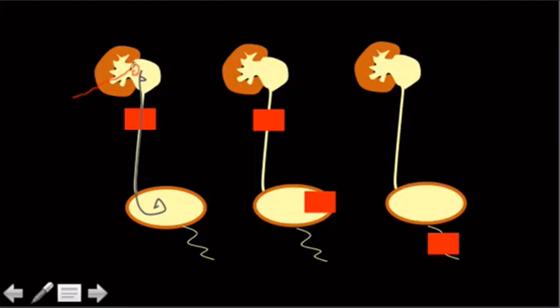And then, once it's working, you can pull it out. But his ideal scenario would be to internalize the drainage to get past that obstruction.